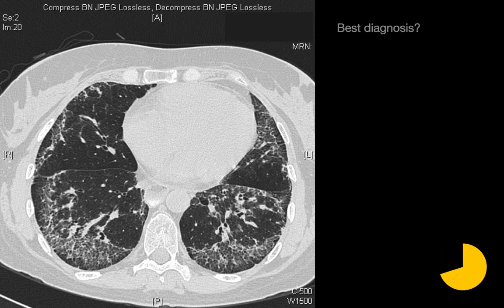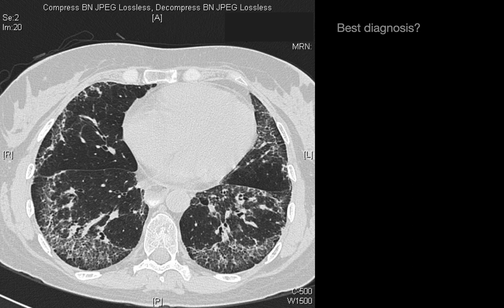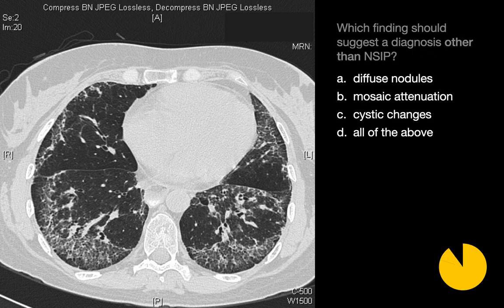What's your best diagnosis? In this case, we see peripheral reticular interstitial fibrosis with quite a bit of ground glass opacities, which would make us consider the possibility we're dealing with NSIP as opposed to UIP. We see that the esophagus on this image is dilated — even though this is a lung window, you can just see to the right of the descending aorta a dilated, debris-filled esophagus. With this kind of presentation, we would consider NSIP as a possible explanation and favor something like scleroderma as the cause of the NSIP.